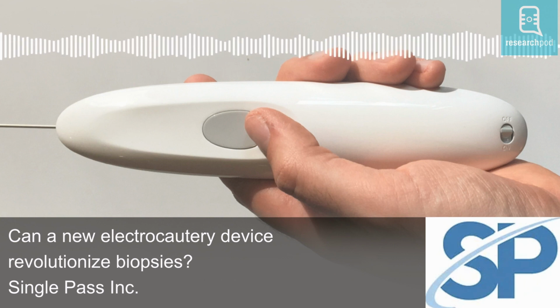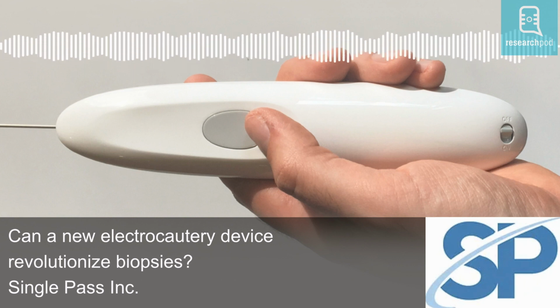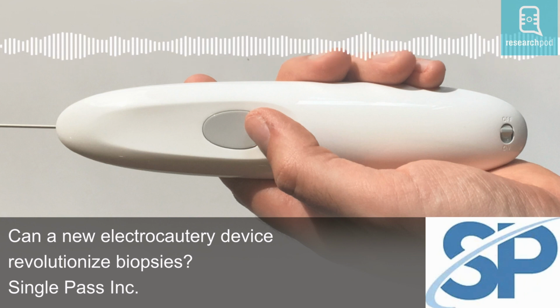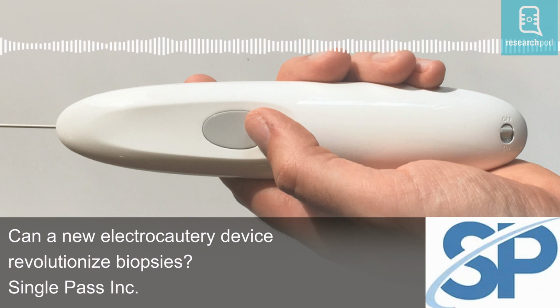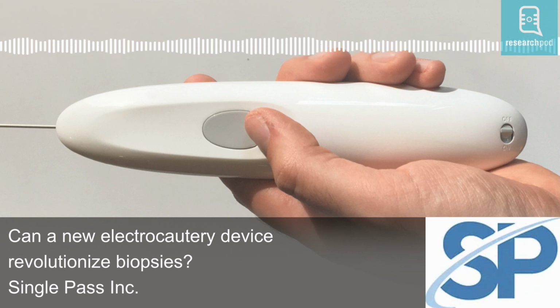Every year, millions of people require organ biopsies. These are intrusive procedures where doctors remove a small piece of the organ for further study. For example, if a tumor is found within a patient's organ, a biopsy can be performed to check whether the cells are cancerous or not. Traditionally, this is done with a biopsy gun that is placed through a guide needle, a special type of hollow needle which is inserted into the organ with the guidance of X-ray, ultrasound, CT scan, or MRI scan.